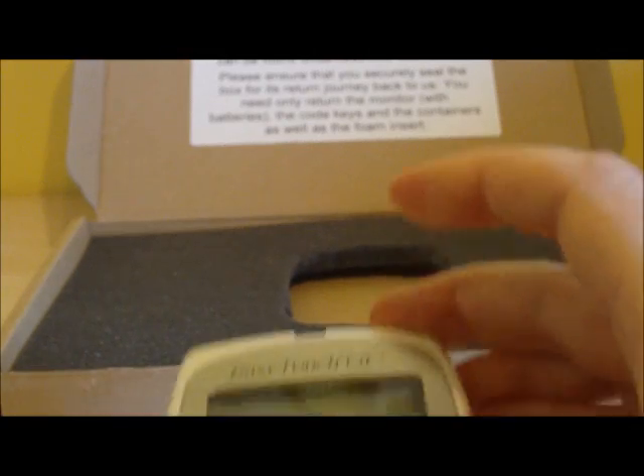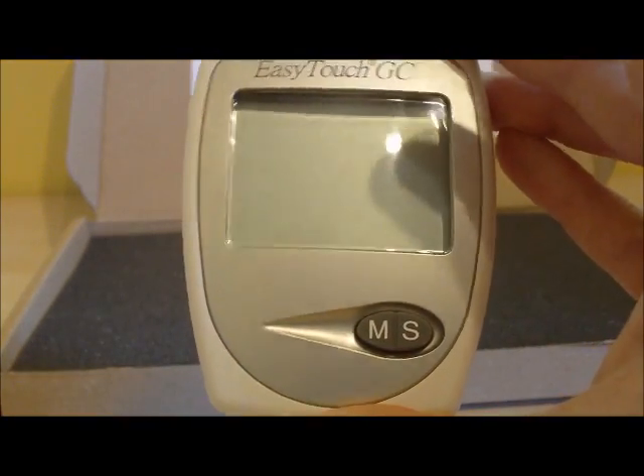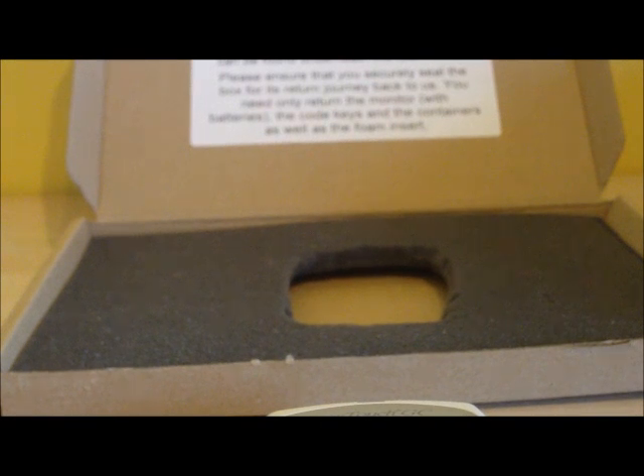We are now ready to measure our glucose level — specifically our fasting glucose level. That means not eating or drinking anything apart from water in the 8 hours prior to this test. Most people find it easiest to fast overnight so they can do this first thing in the morning before having a cup of tea, coffee or anything to eat. You are still allowed to drink water throughout this time, but it is important that you do not eat any foods.